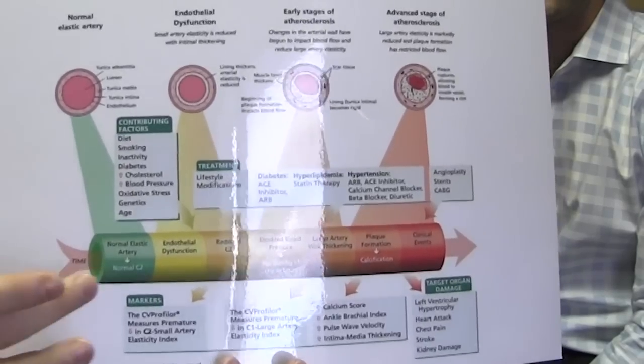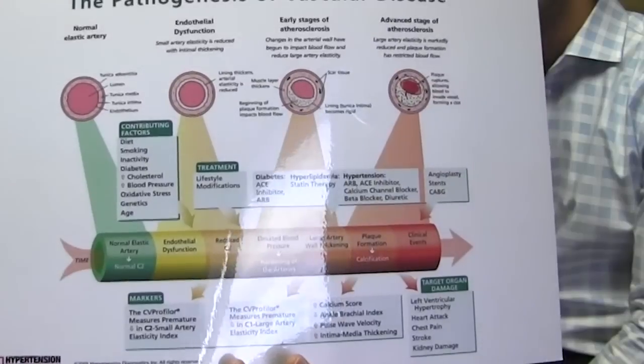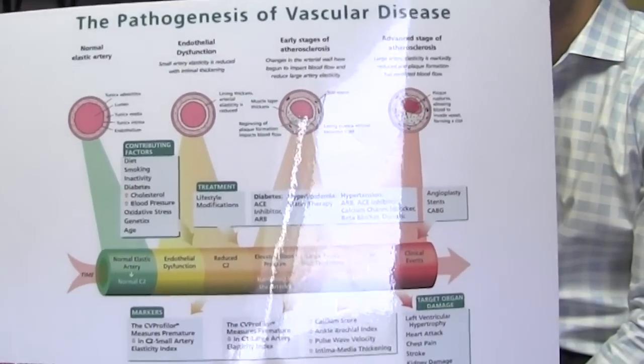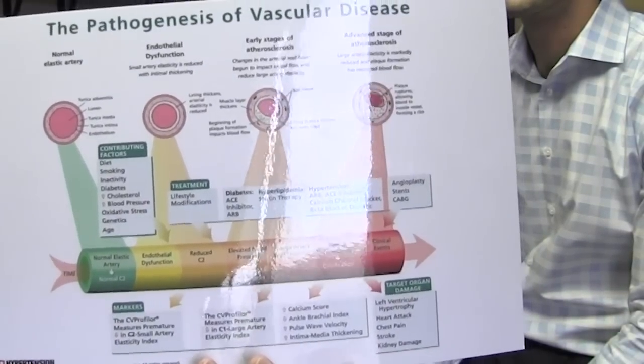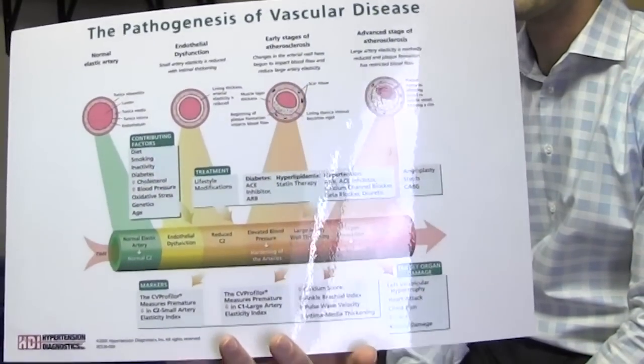The second change is right here in this zone, called the C2, or we call it a loss of arterial elasticity of the small vessels. That is the first structural signal where it changes, where we can say the disease or the process of the vessel being diseased is more progressive. It's progressing towards further disease. And so what we are looking for is the reduced arterial elasticity, if it's there or not. And when we take that measurement, we will know where along the spectrum the disease process is in the vessel.